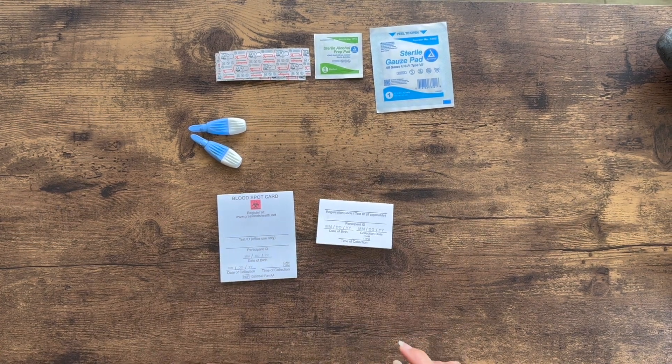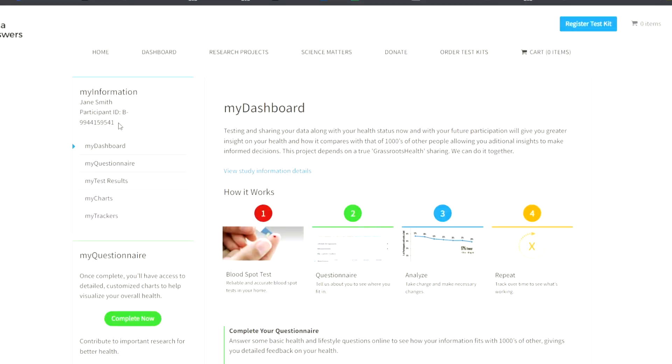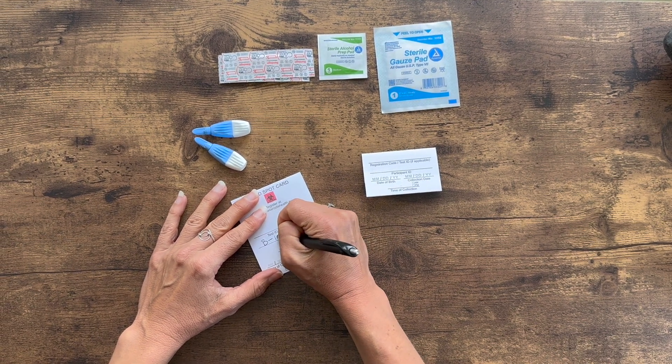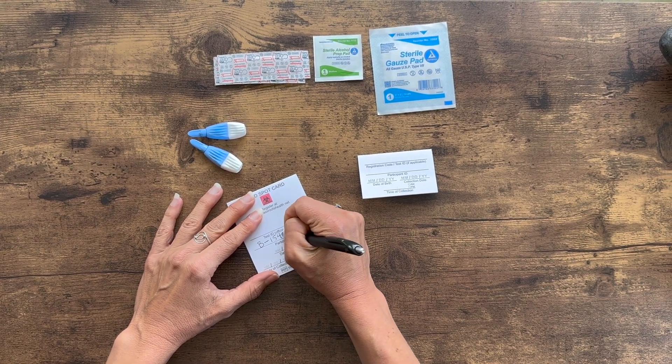To finish the blood spot test, locate your participant ID located on the upper left corner of your account dashboard. Write your ID along with your date of birth and the date and time of collection on the back of your blood spot cards.